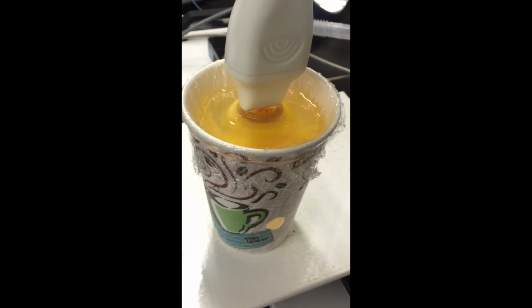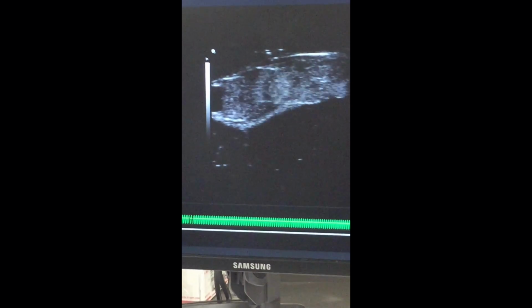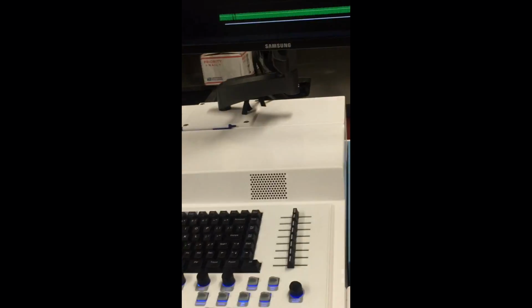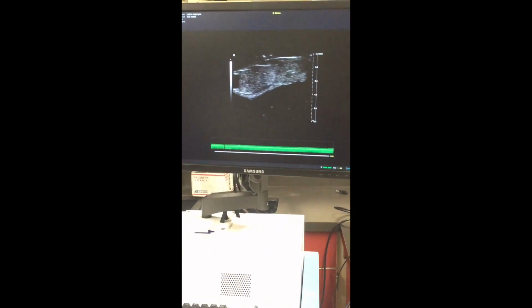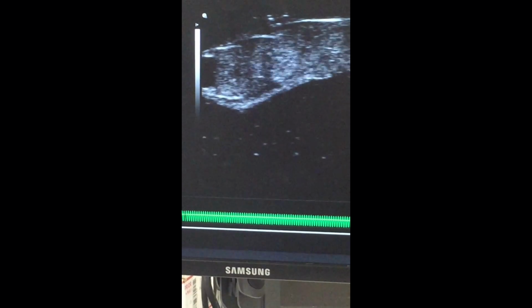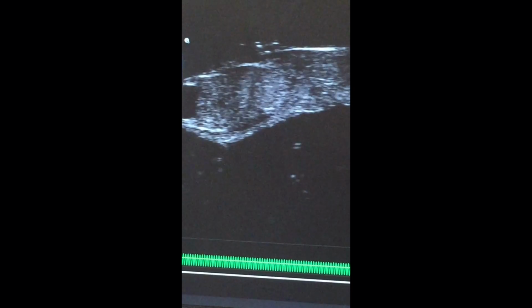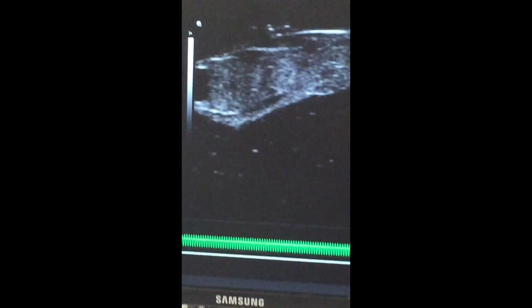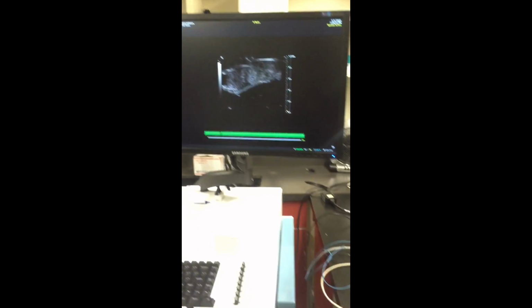The last step of the experiment is performing an echo on the embryo's heart. The echo machine gives us live images of the heart while it's beating. It measures the diastolic and systolic ratio of the heart. Using this information, we compare how the untreated eggs were healthier than those injected with TCE. This is just the preliminary data, but we hope to further the experiment in order to show how TCE affects an embryo during heart development.